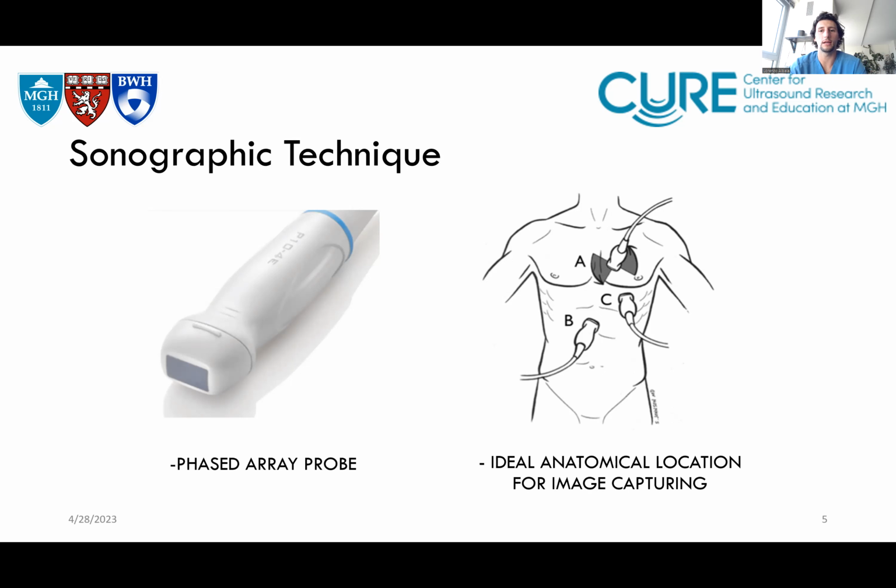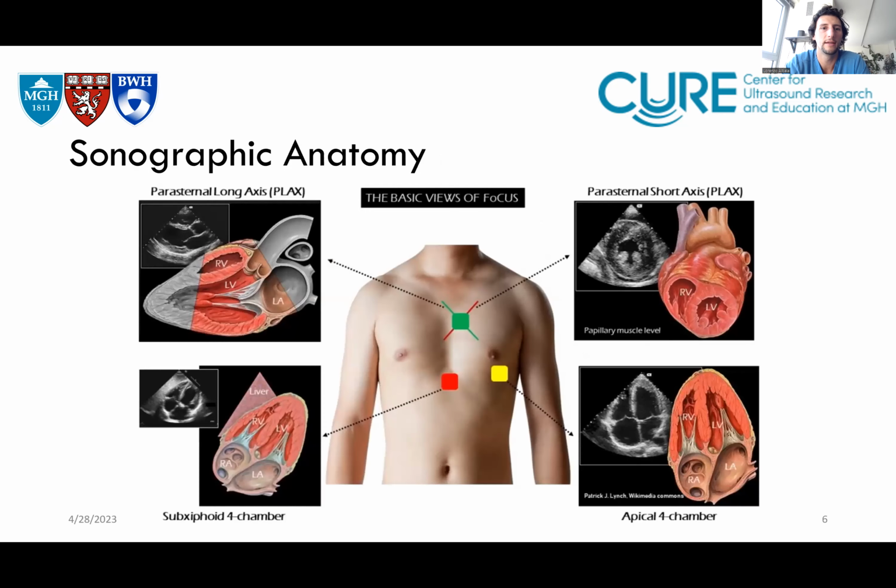And then all you need to do to get the short axis is rotate 90 degrees. And so that's in that diagram. That's what you're seeing with those arrows. And then you just slide around to get to the other spots. So we'll get into more of that in a second.